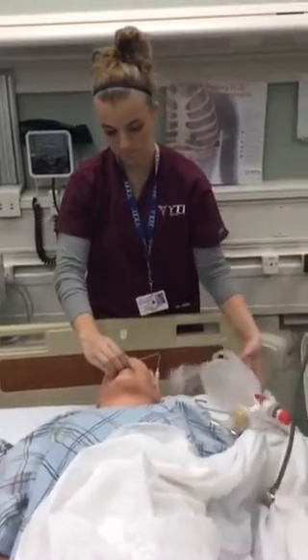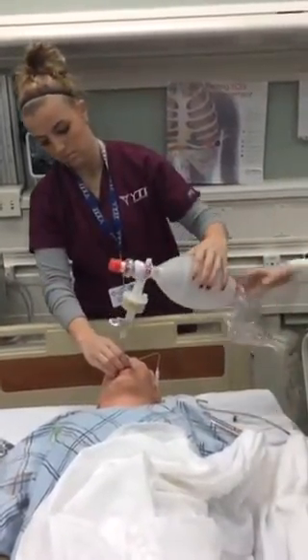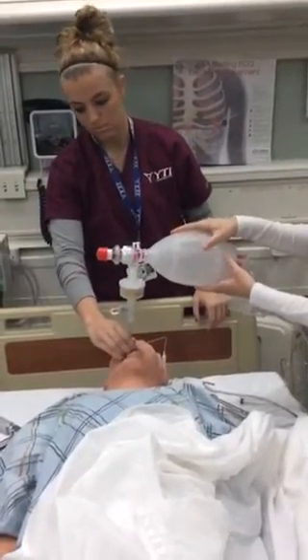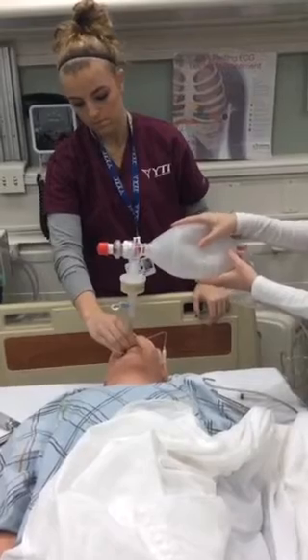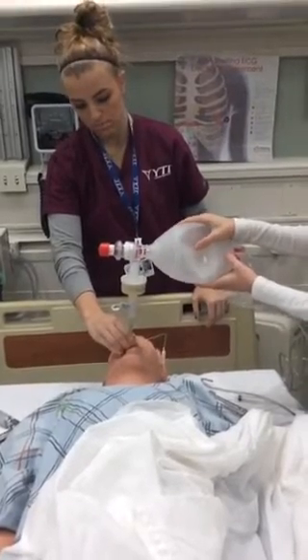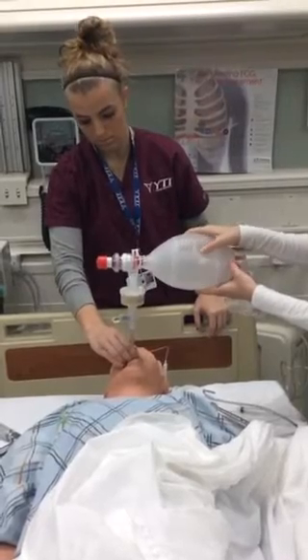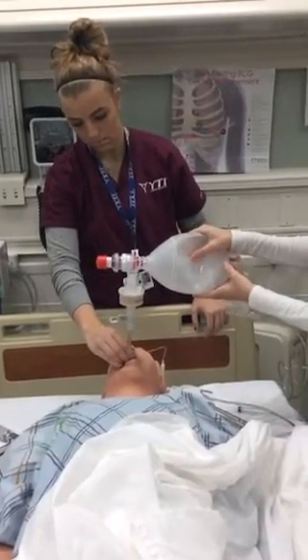Another method to determine whether the tube is in the airway is by exhaled CO2 analysis, or capnometry. If the ET tube is in the airway, CO2 levels begin to rise. End-tidal CO2 levels are generally around 6%. If the tube is in the esophagus, the end-tidal CO2 reading remains 0.